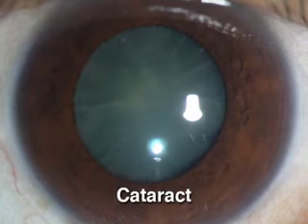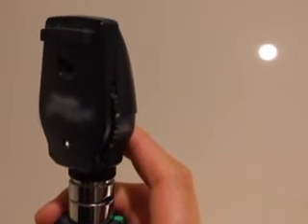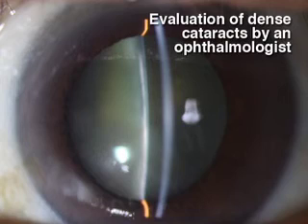Patients with cataracts may have a diminished or absent red reflex. To obtain the best visualization of the fundus, try reducing the size of the aperture in order to minimize light scattering. It may not be possible to visualize the fundus in patients with dense cataracts. Refer patients with dense cataracts to an ophthalmologist.